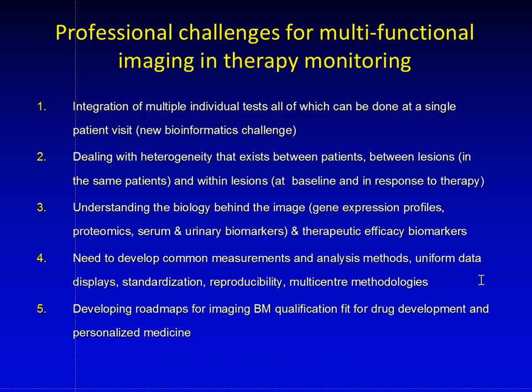What are the professional challenges of multifunctional imaging like this in therapy monitoring? Well, one of our biggest challenges is that we are doing multiple tests. So in the bone marrow, it's fat fraction, it's ADC maps, it's CT Hounsfield units, it's activity on a PET scan, it's all kinds of stuff. And when we acquire these sources of data, then integrating them is a real bioinformatics challenge.